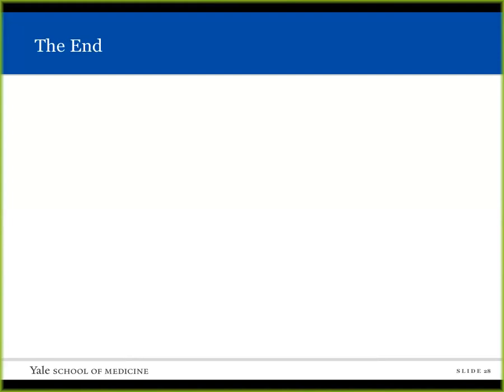This is a question more for Dr. Motivadian. We had talked once about the Moses technology. Are we going to test it out here, or was there ever a plan for that? The 120 watt laser, probably the best thing for it is that you can do pop-dusting. We're thinking about doing it, but you need a high wattage laser in order to dust because of the high frequency. If you're basketing at 0.8 and 8, you're at 6.4 watts, whereas if you're at 0.2 and 50, you're at 10 watts. So dusting actually requires a stronger laser.